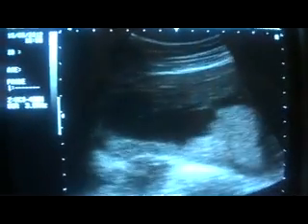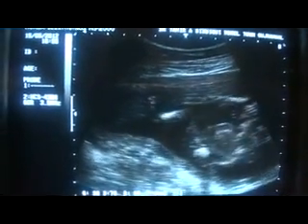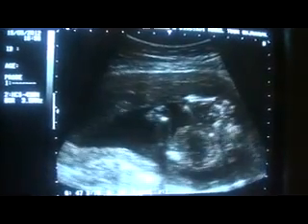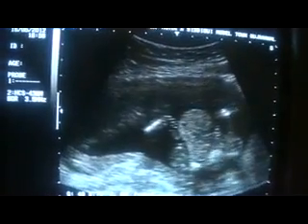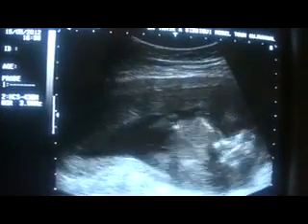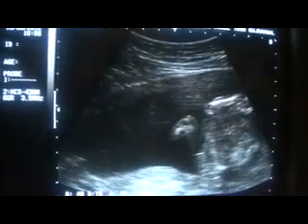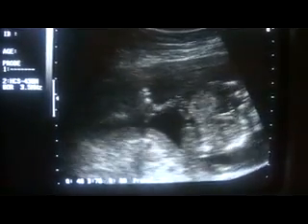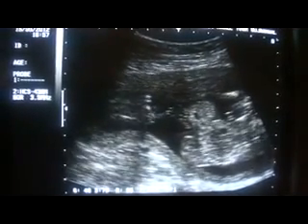Okay. Whereas now see the body of the fetus. Transverse section. I am in fact trying to get the body of the fetus in transverse section.